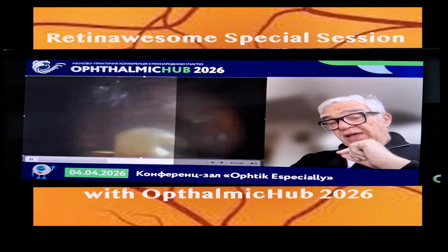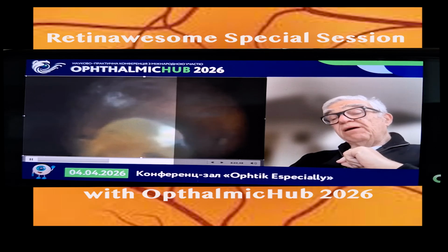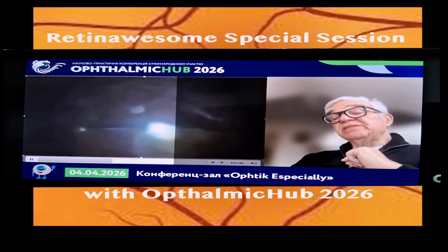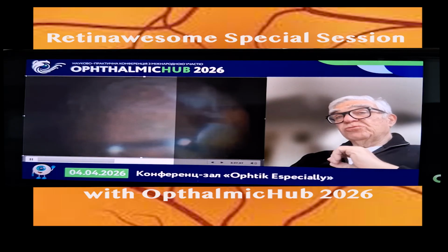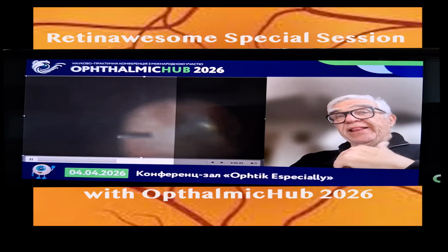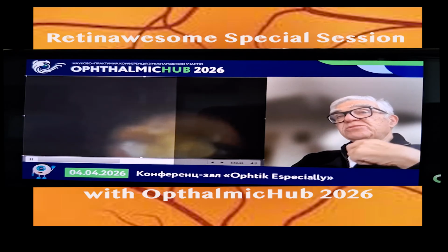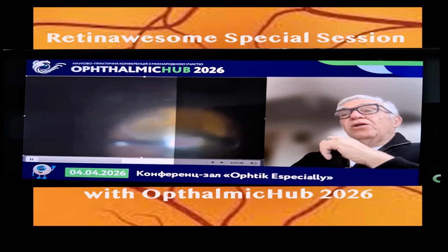Another thing about phacoemulsification is that you need to hold the lens and zap it a few times and keep the end of the phaco emulsifier always inside of the nucleus, because if you do a lot of intense phacoemulsification inside the vitreous cavity, and it goes through the nucleus from one end to the other while doing the tapping, then because you have a 19 gauge usually and a 25 gauge infusion cannula, you're going to suck fluid, BSS, that you got inside the eye, and you might have a choroidal detachment from the sudden loss of pressure.